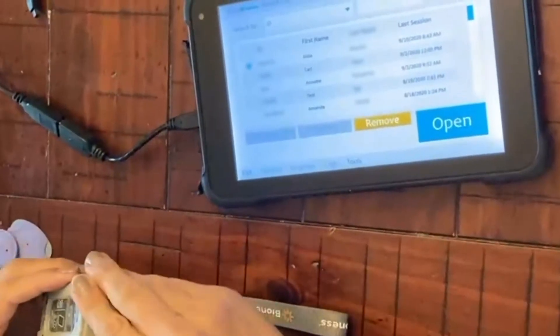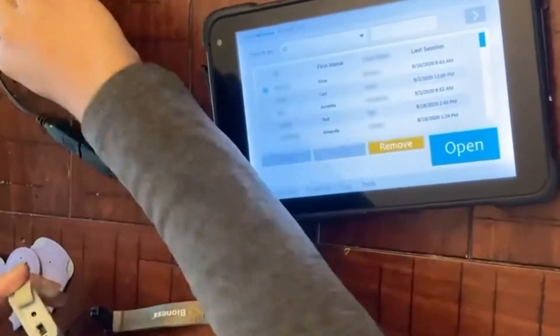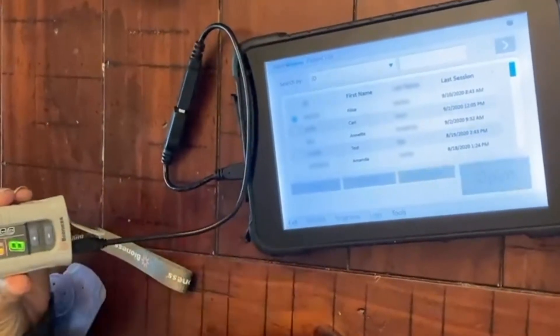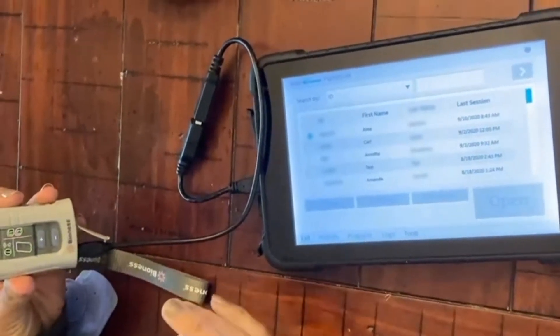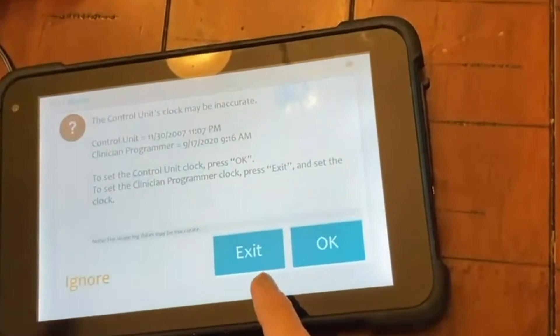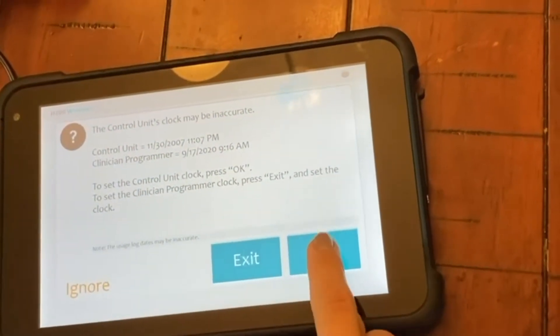From the off position, you're going to want to plug the control unit into the programmer. The control unit will automatically turn on once it's plugged in. It may let you know that the control unit time is different than the programmer's time. Just press OK.